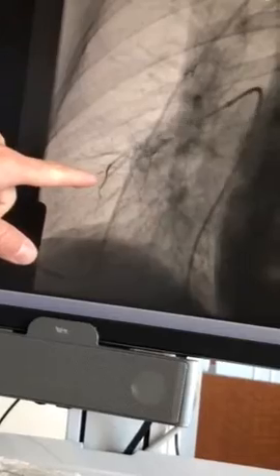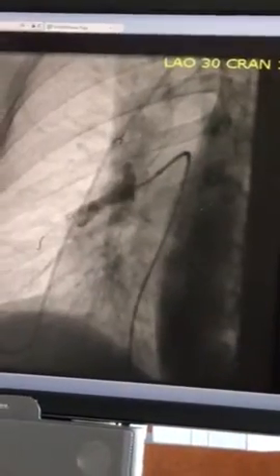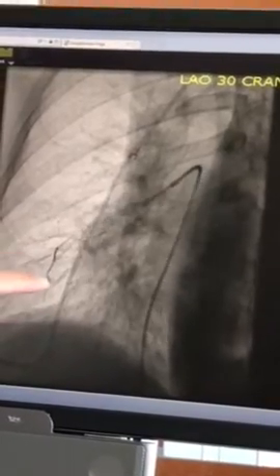And so here we are. We're back to that more lateral view. So if we compare this one to this one. Yeah, there's nothing. Right, and then here the wire's through, so you're already picking up flow out there and flow out here as we sort of balloon it.